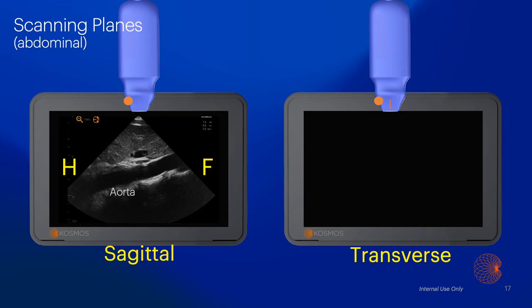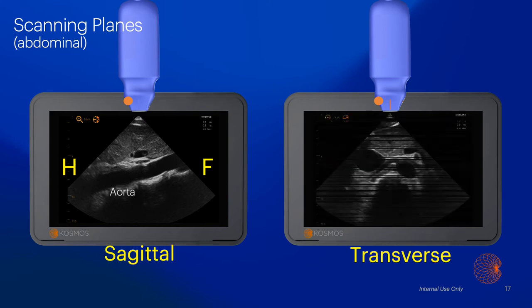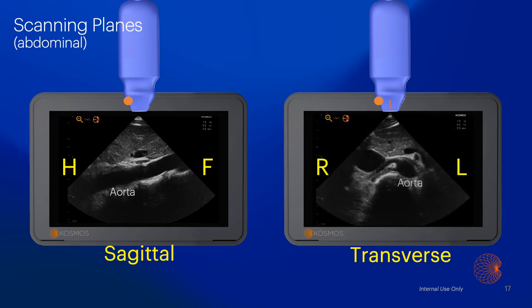The left side of the image is representative of anatomy toward the patient's head, and the right side is representative toward their feet. If we now take the transducer and rotate it 90 degrees counter-clockwise, the orange dot orientation mark is now positioned toward the patient's right side, and we can visualize the same anatomy in the third dimension. The orientation of this image is similar to a cross-sectional view on a CT scan, whereby you visualize the patient's right and left sides. There should already be an expectation upon the operator as to which side of the screen will come into view and which side will be leaving when you move the transducer.